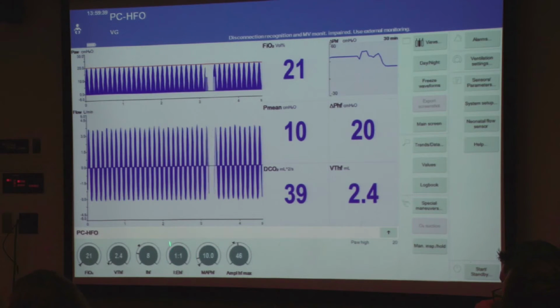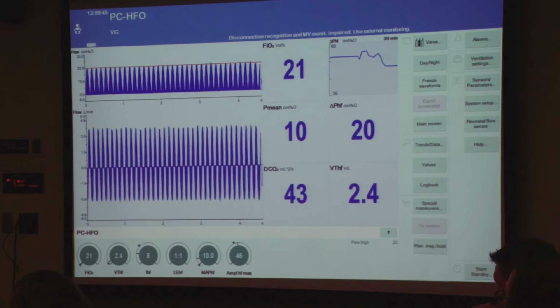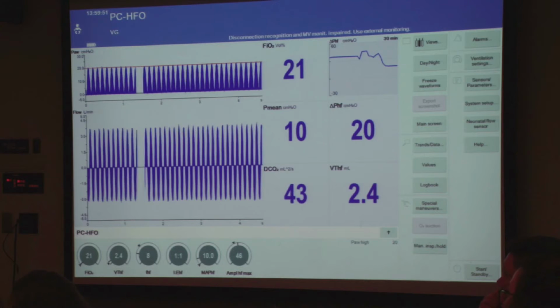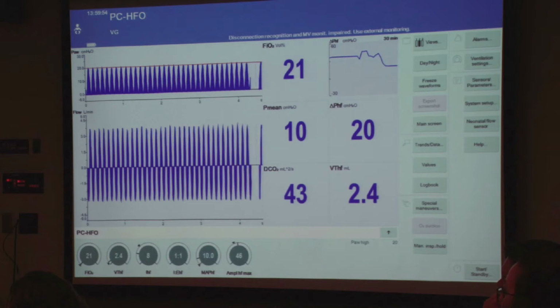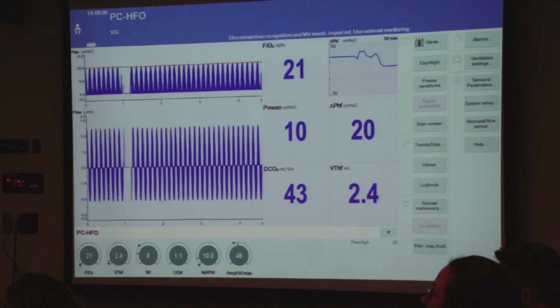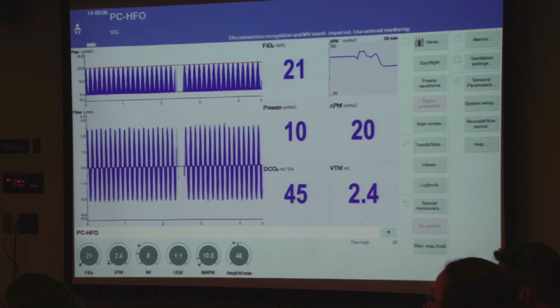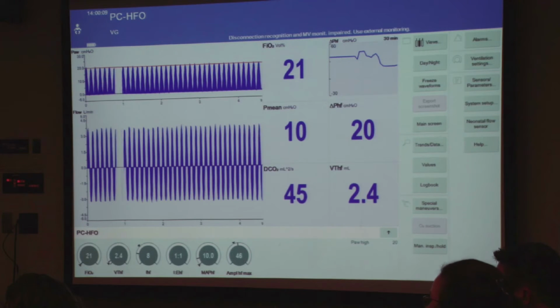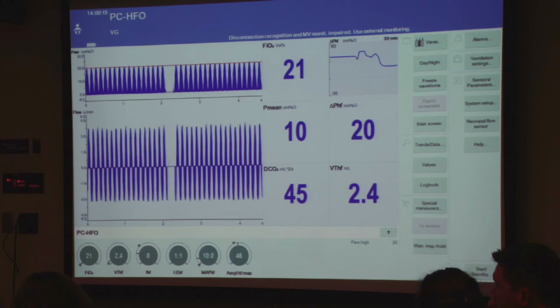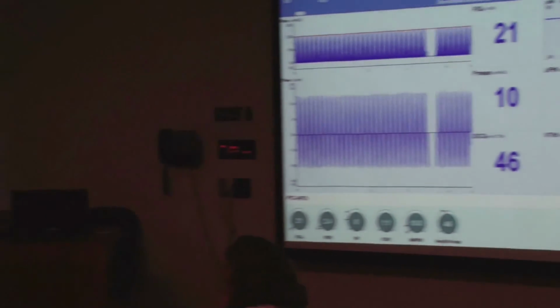If you want oxygenation, obviously, as usual, you would increase mean airway pressure or FiO2. In high frequency, oxygenation gets simpler from the theoretical standpoint, in the sense that you have FiO2 and mean airway pressure, both knobs on the ventilator. With PCO2 in conventional, you have frequency or you increase your tidal volume.